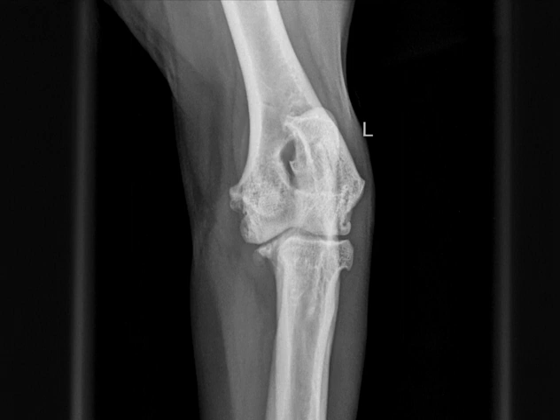Today's example is a 1.5-year-old lab with left front limb lameness for about a month and a half. Be sure to perform a systematic evaluation of this case before you continue with this video. Now, I'll highlight some important findings for elbows in this case.